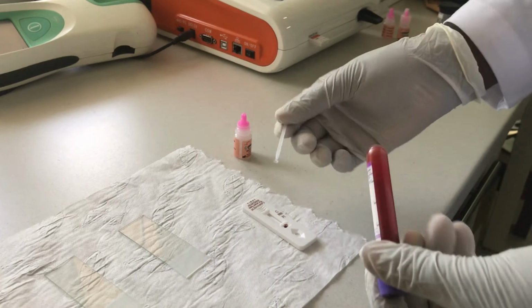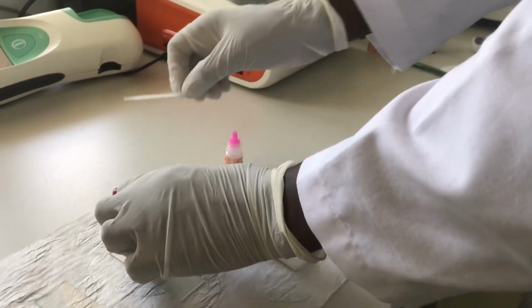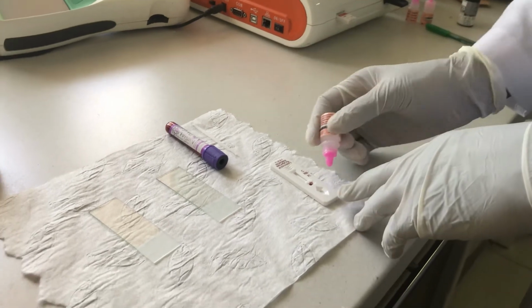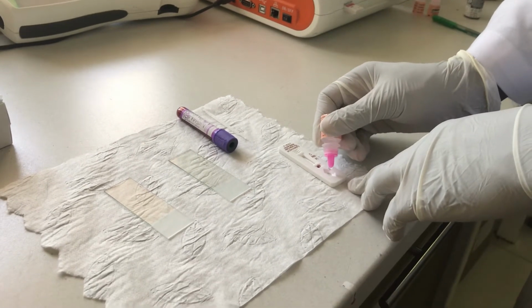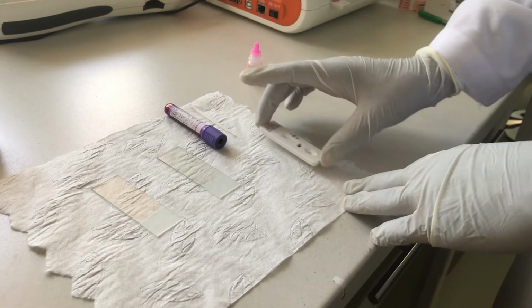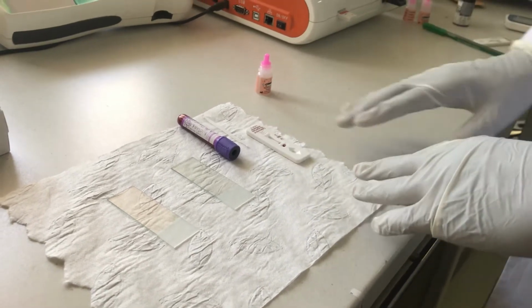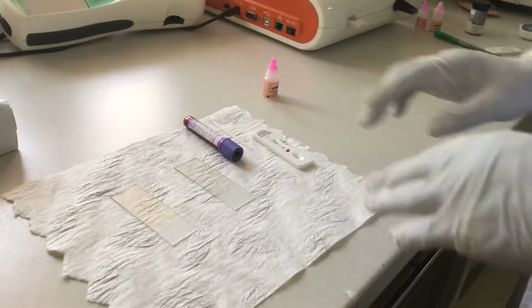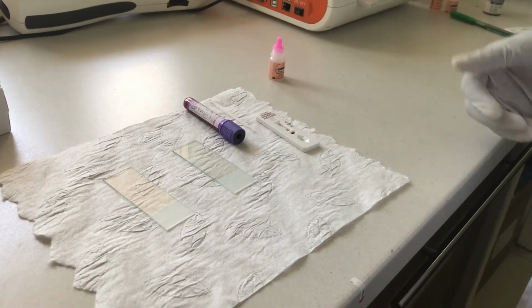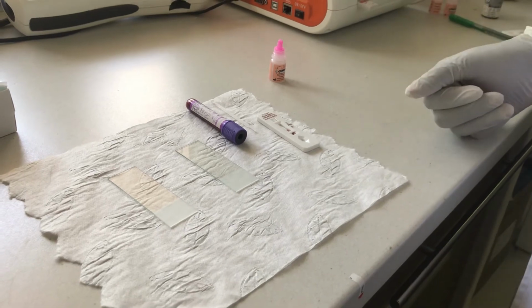So after dispensing your blood, you're able to add a buffer at the buffer point here. Depending on the SOP from the manufacturer of the kit, I've put 3 drops. So you leave this test kit to run for about 10 minutes, 10 to 15 minutes, and it will give you your results.